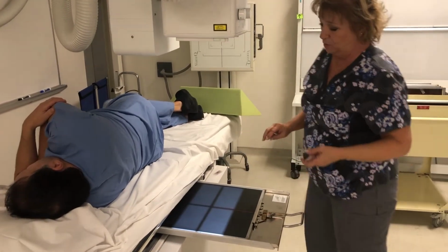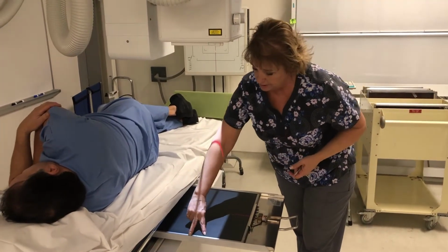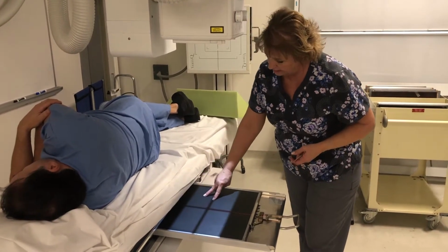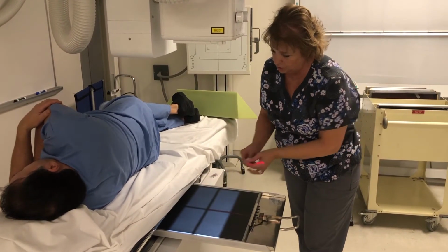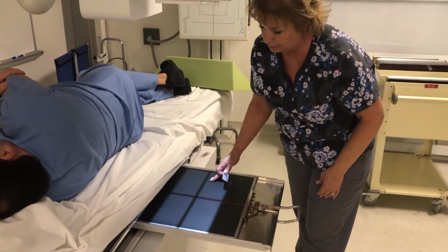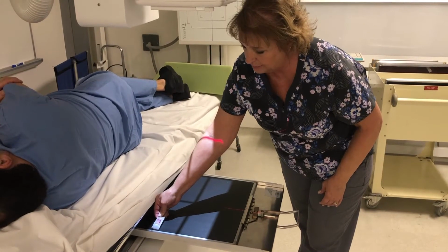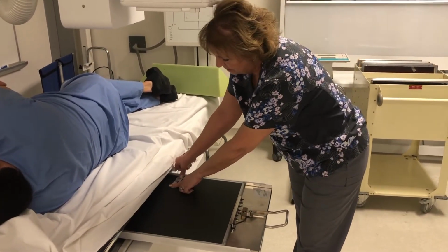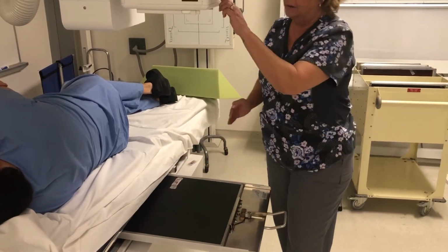Now you have to imagine where the spine's going to end up. So there's a lordotic curve to it, so it's going to curve like this and then come back like this. So you would not want to put your marker right in the middle because that's the most anterior point of the spine. You either want to keep it proximal or distal. So I'm going to choose to put this distal, and my sacrum should be angling away from it.